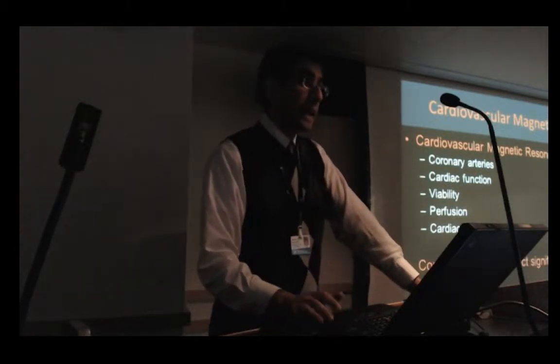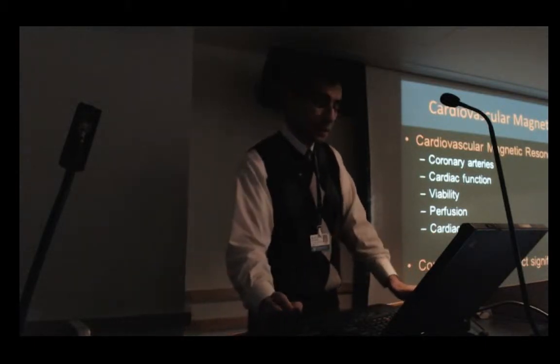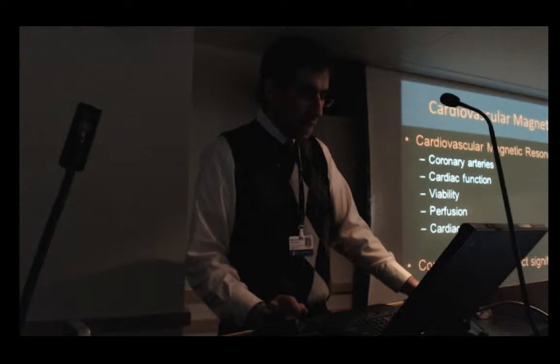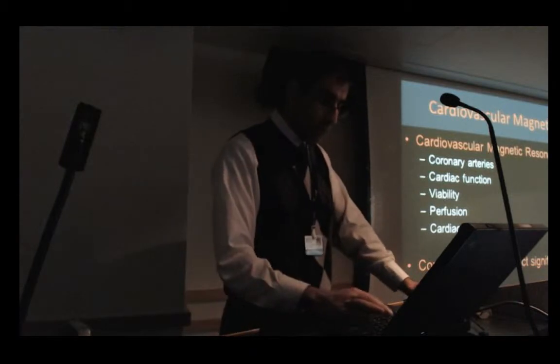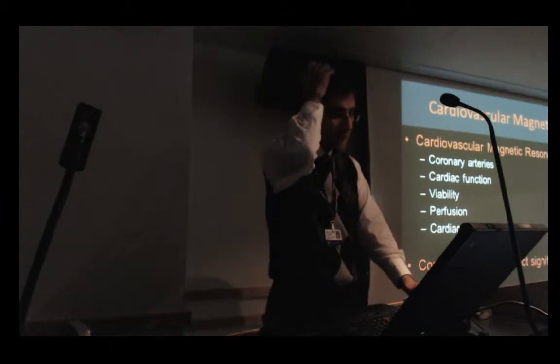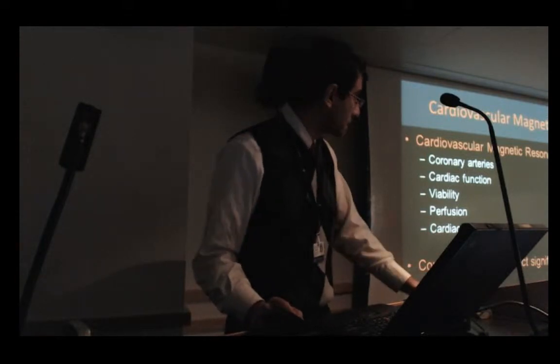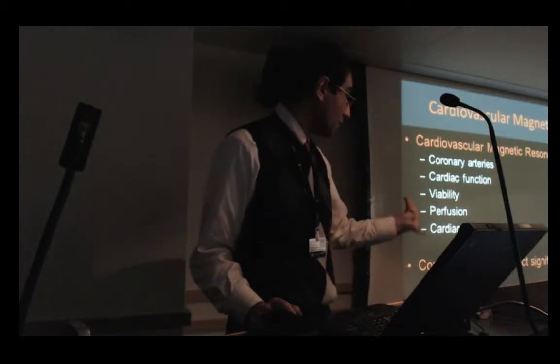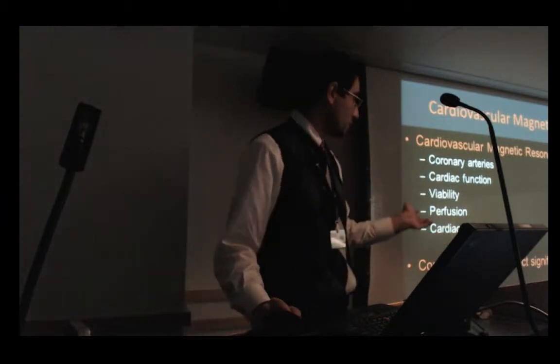Moreover, recently there has been a multi-center study in Japan showing that coronary MRI can rule out coronary artery disease with a negative predictive value of 88%. They scanned around 138 patients. They could complete the scan of 127 patients using coronary MRI, and they showed that coronary MRI has a sensitivity of 88% and a specificity of 72% to detect coronary artery disease. As you can see, the sensitivity and specificity are not 100%, and also we couldn't image 10% of the patients due to the clinical challenges of coronary MRI.